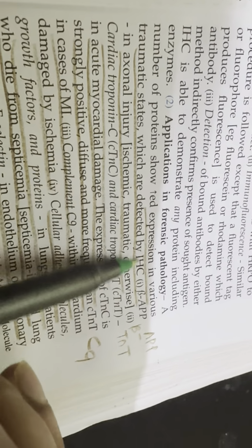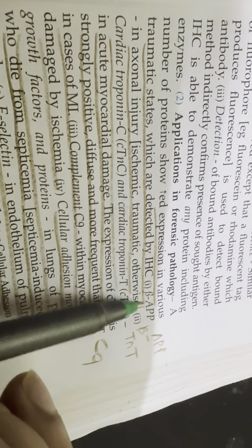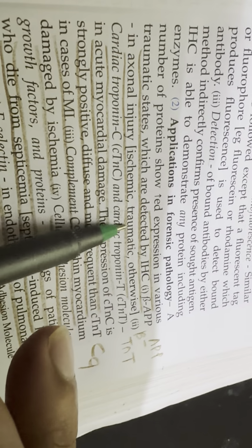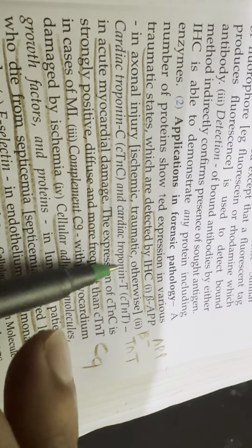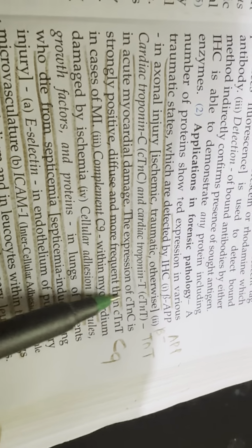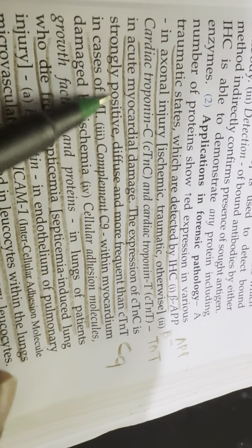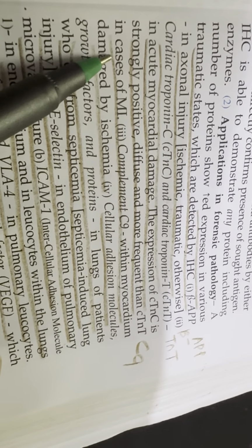Application in forensic pathology. A number of proteins show increased expression in various traumatic states, which are detected by immunohistochemistry. Beta amyloid precursor protein in axonal injury, ischemic, traumatic or otherwise. Cardiac troponin C, cardiac troponin T in acute myocardial damage. Expression of cardiac troponin C is strongly positive, diffuse and more frequent than cardiac troponin T.